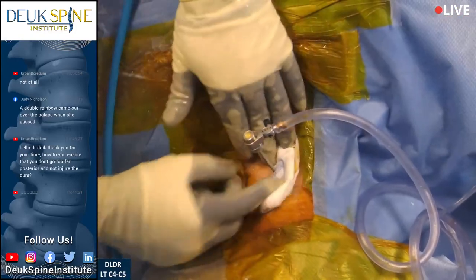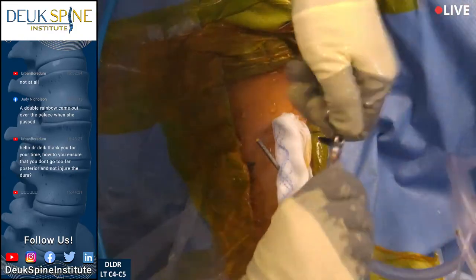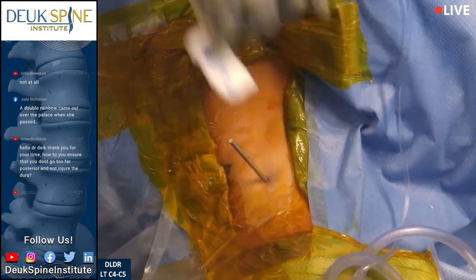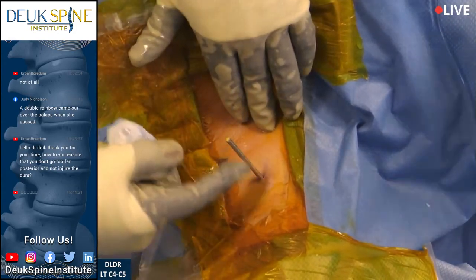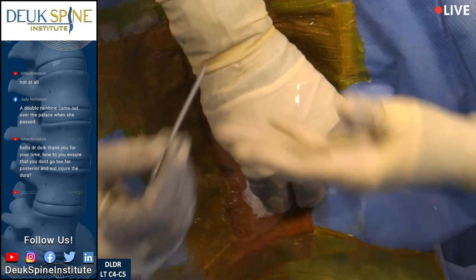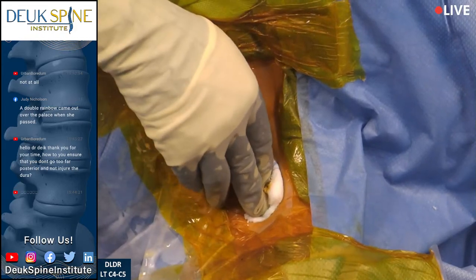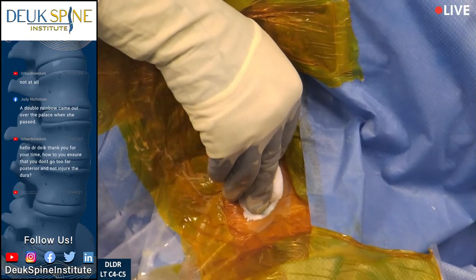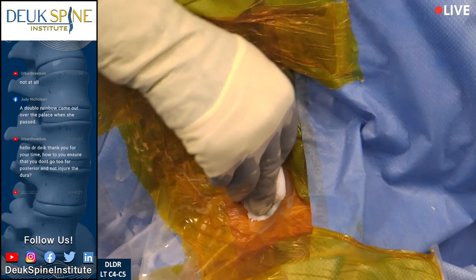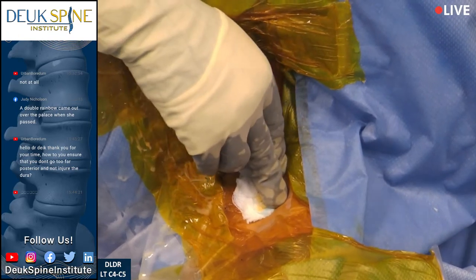I'm going to show you this tube — you see that? The whole surgery was done with this tube. This is truly minimally invasive. When I have surgeons tell me 'Oh yeah, I do minimally invasive surgery,' I laugh to myself — it would be rude to laugh in their faces. I just let them go on believing what a great job they're doing, and I come back here and do a really great job for our patients.